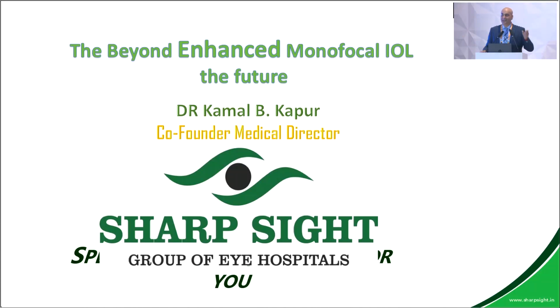So basic point is have an autorefractor keratometer, use the pupillary marker, and have two optometrists do an independent data. Don't let anybody look at each other's data, and we'll get a fairly very accurate result. For my practice, I use a caliper only to confirm, not as the primary.